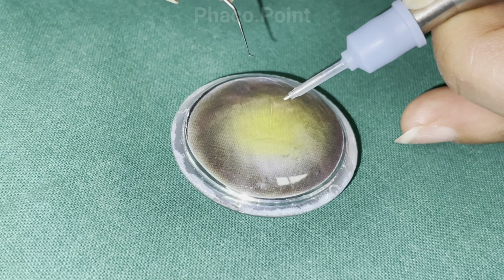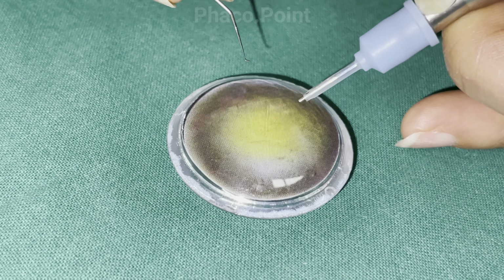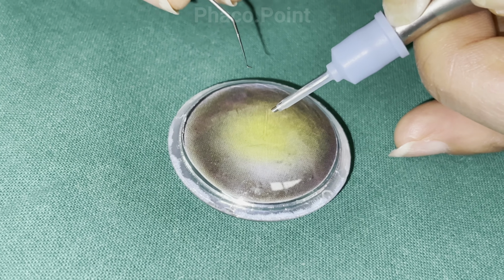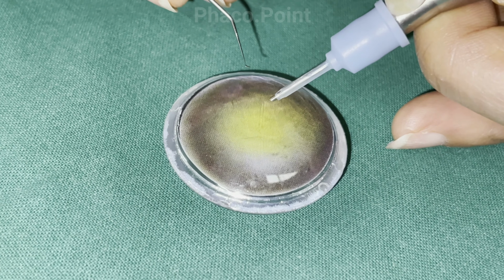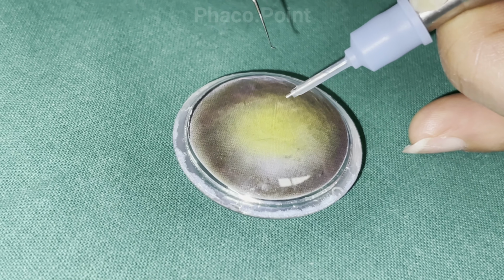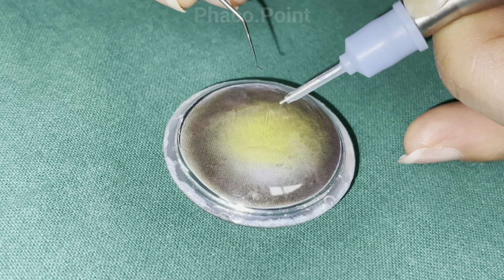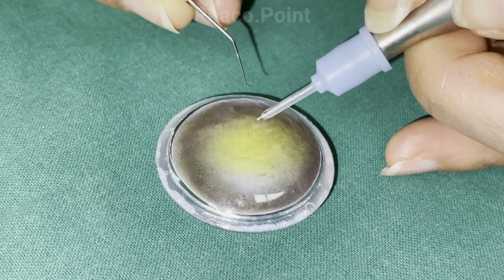Why do you stop in foot pedal 2? Because once you've got to the depth, you need the phaco energy only to go all the way to impale the nucleus to get a good hold in its depth. Once you get that hold, your foot pedal moves to foot pedal 2. The importance of this is to understand that if you were to remain in foot pedal 3, you would go through and through the nucleus and into the posterior capsule.